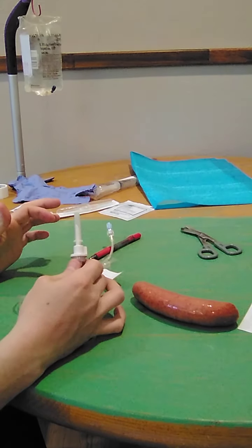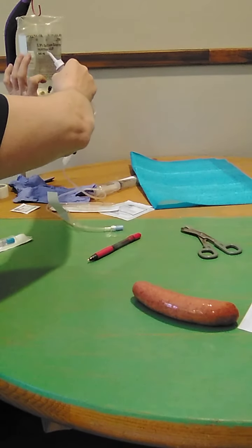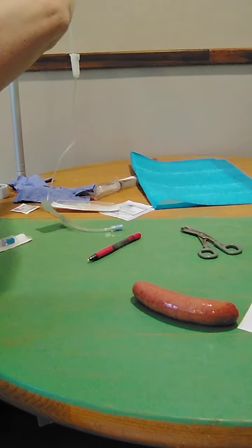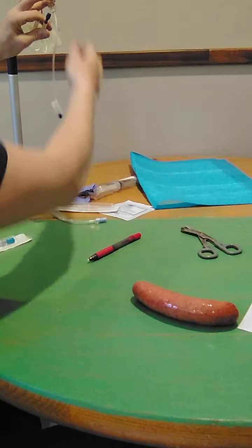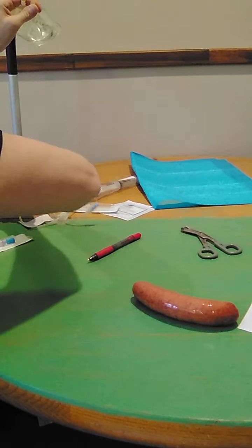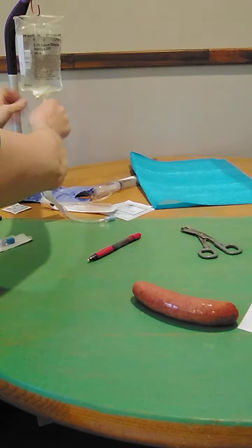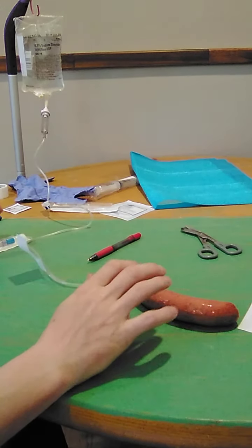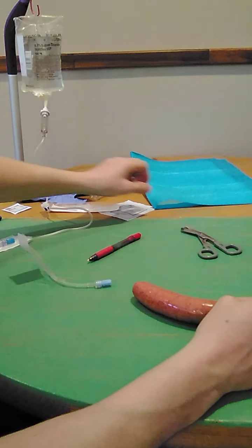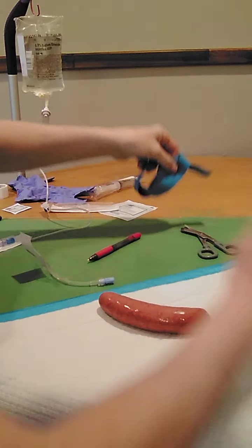So I'm going to remove this cover on the spike, maintaining its sterility, and I'm going to pierce this solution. And I've locked my saline with its valve. Pierce that. And that looks fine. I'm going to get my linen barrier placed under the patient's extremity that they prefer.